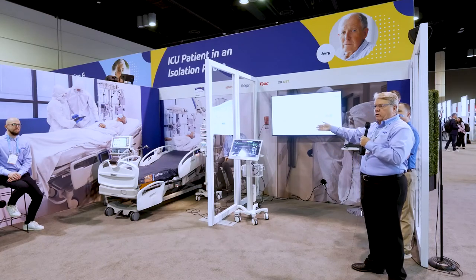Several days later, Jerry has been recovering very well. He's tolerated his non-invasive ventilation and is thankfully getting on the mend, hopefully to be discharged soon. By utilizing open medical device standards with the point-of-care cockpit, ventilator, patient monitor, and syringe pumps, our hospital was able to provide Jerry the best care possible while maintaining staff safety by limiting the number of times they needed to enter the room and expose themselves to potential pathogens. Thank you for attending — please ask any questions and feel free to take a copy of our white paper or scan the barcode for a PDF.